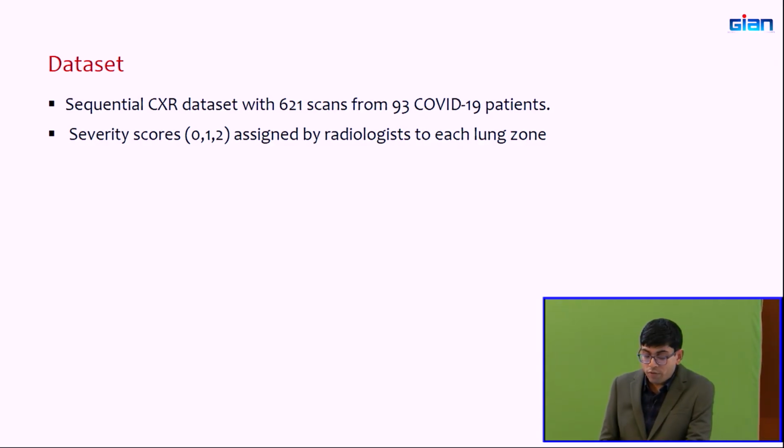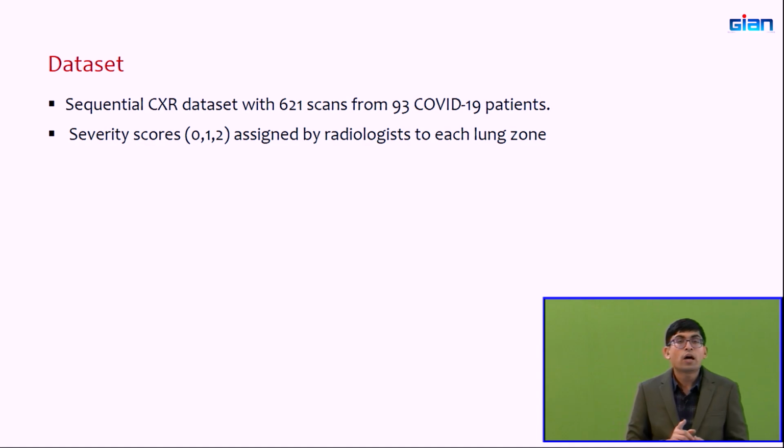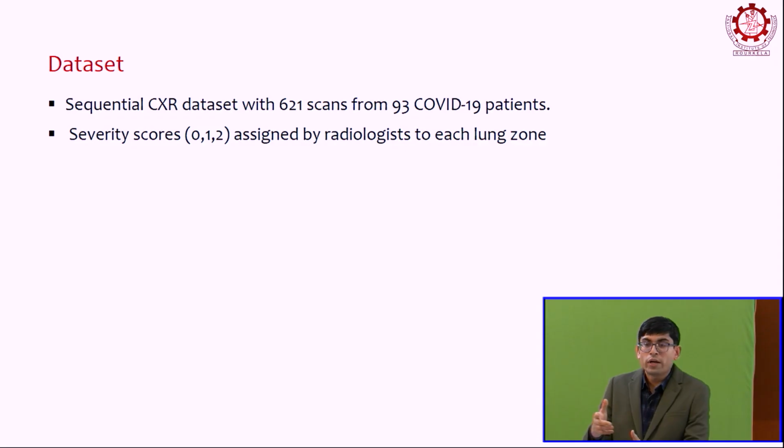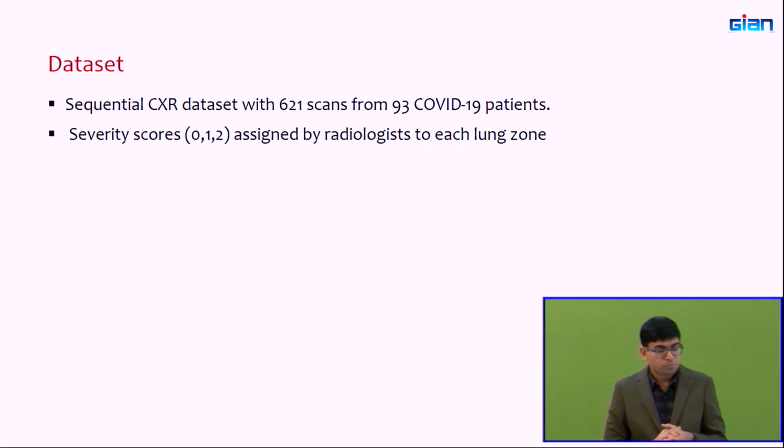Why I'm giving this example of these COVID-19 papers is that a lot of times the images that were taken to train the machine learning models were scraped from the web. Basically, there were clinicians who were publishing papers and the PDFs were out there. People would take the PDFs, scrape the images out of them and use that for machine learning model training. That's not how we should be training these models. Let's say you have a native X-ray, a native scan, collected using some GE, Siemens or Philips scanner. The format in which these images are saved is called DICOM.